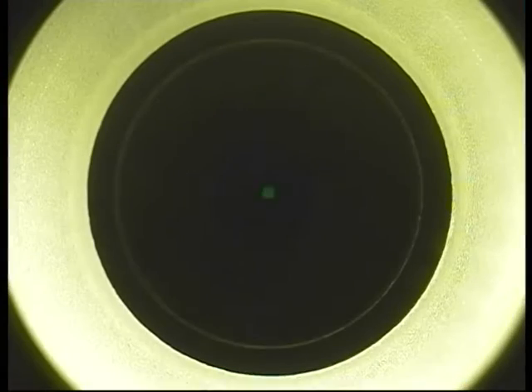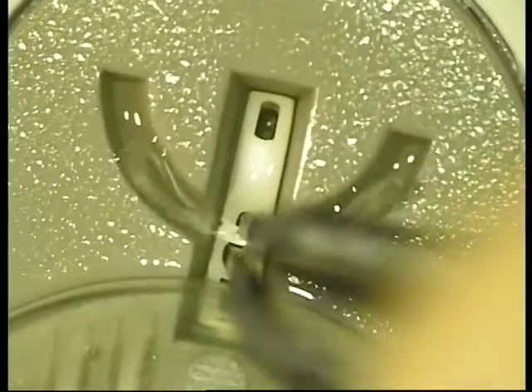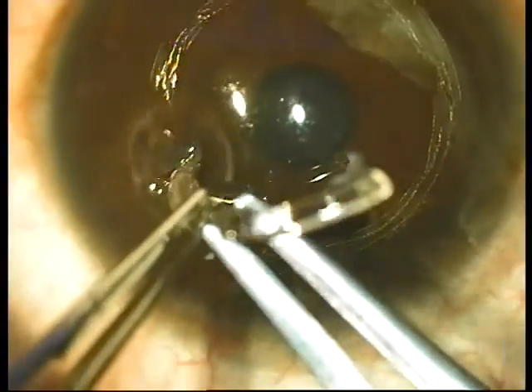The patient improved to about 6/36 with retinal acuity meter. The question was whether this was amblyopia or aberopia. Since the age of onset of keratoconus is generally after the amblyopiogenic age, the chances of this being a pure amblyopia were low. We decided to do an INTACS followed by cross-linking in a simultaneous procedure.